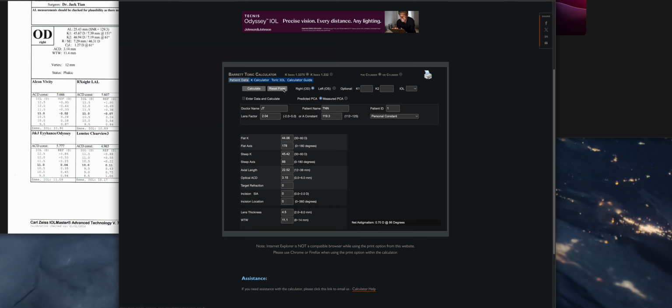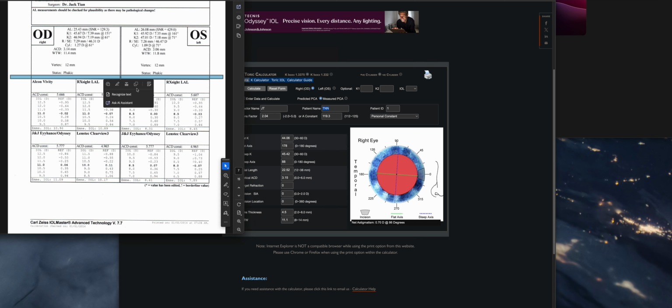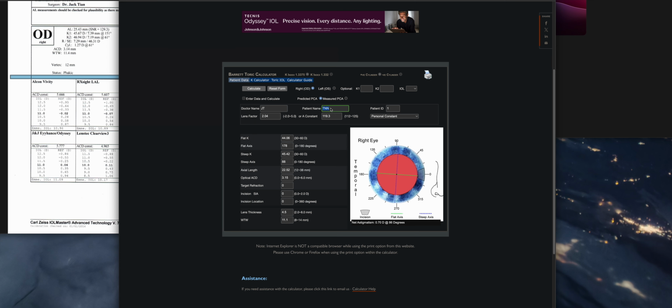All right, we're gonna do the next patient here. Right eye. Perfect. Calculate.